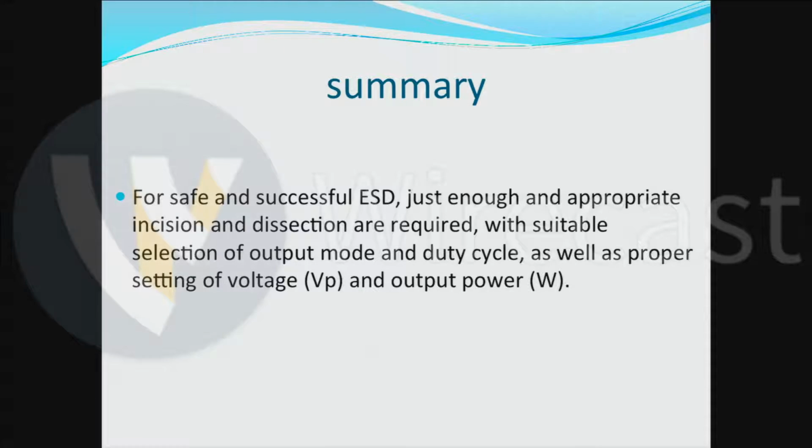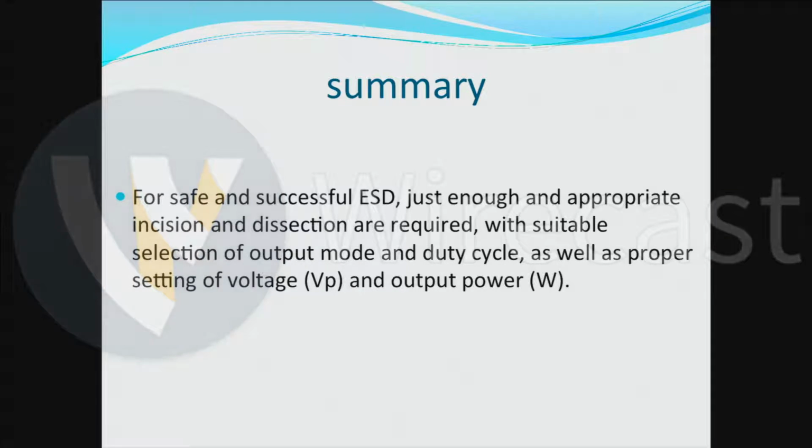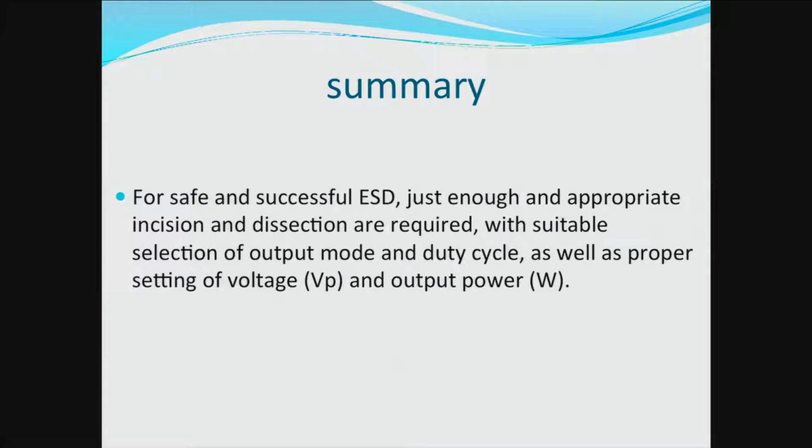Would the effect be any different? And if I use a needle knife to do a coagulation, will it act like a cutting?